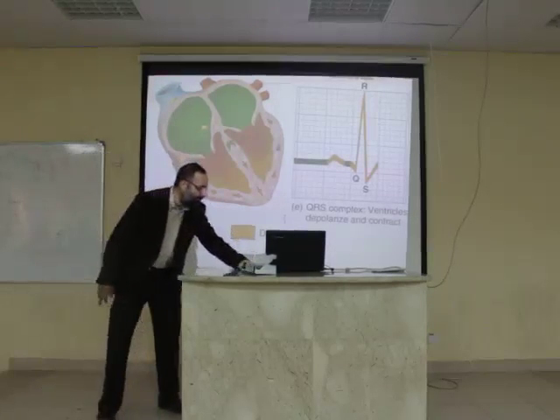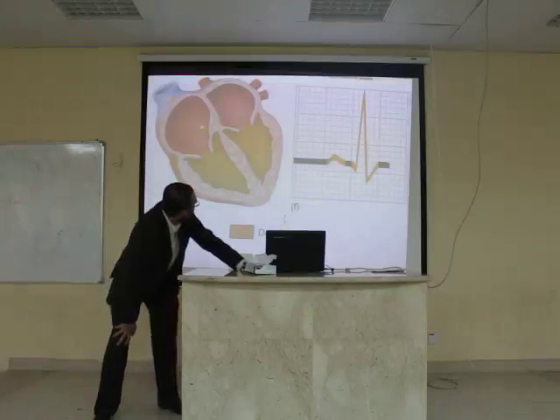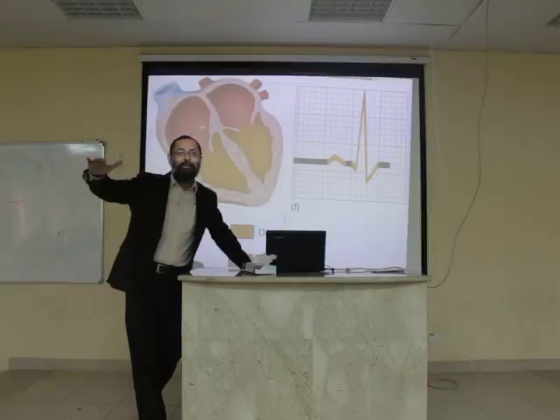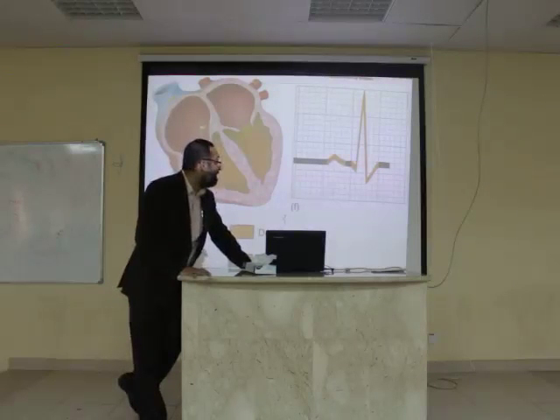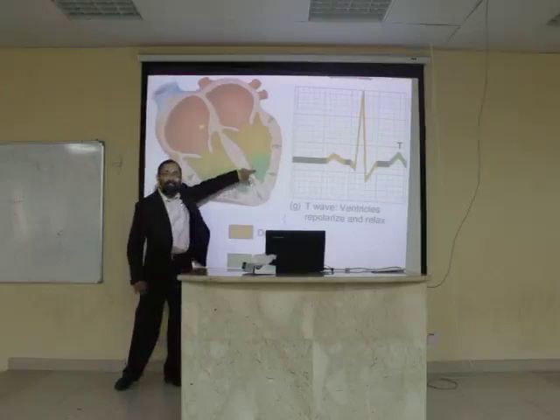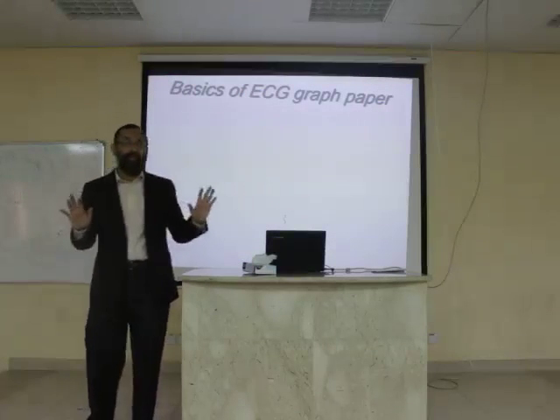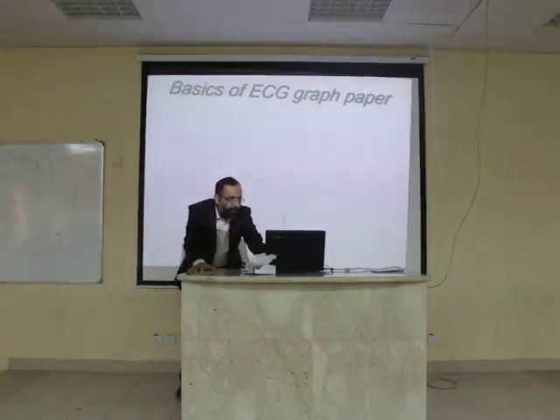Color change coming in. Alright. What is there? Depolarization is finished and a slow process of plateau has begun. A little time is there and you have that segment, isn't it? Yes. Now what is forming? Repolarization. The color is changing, the green color. Now the repolarization has started. Did you get that? Yes. Okay. So now you know the basic interpretations. Alright?